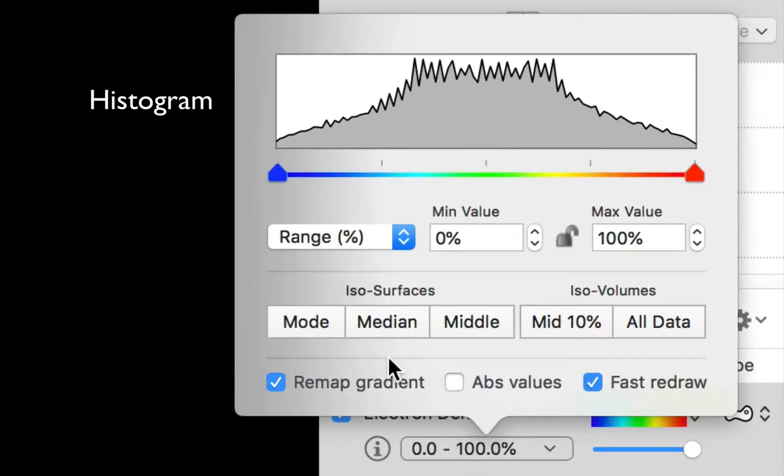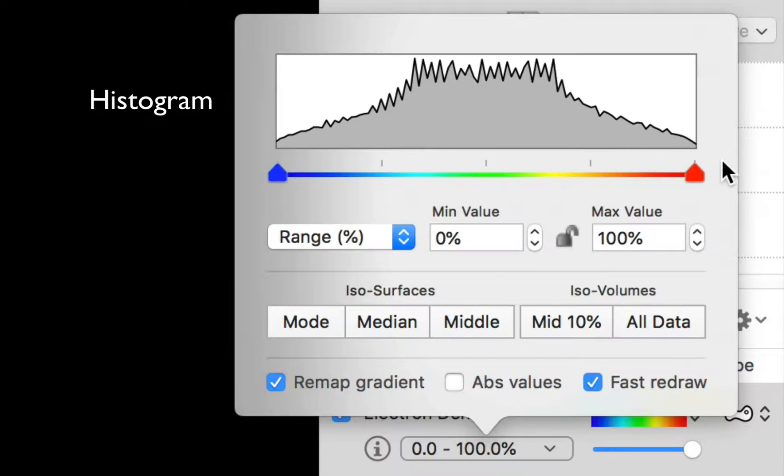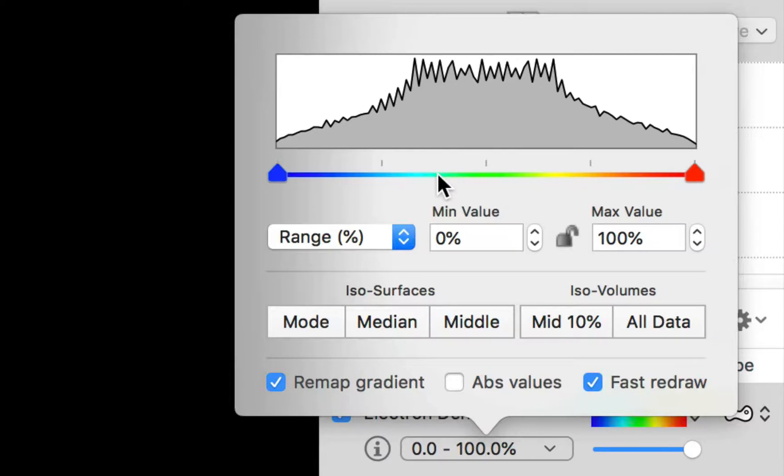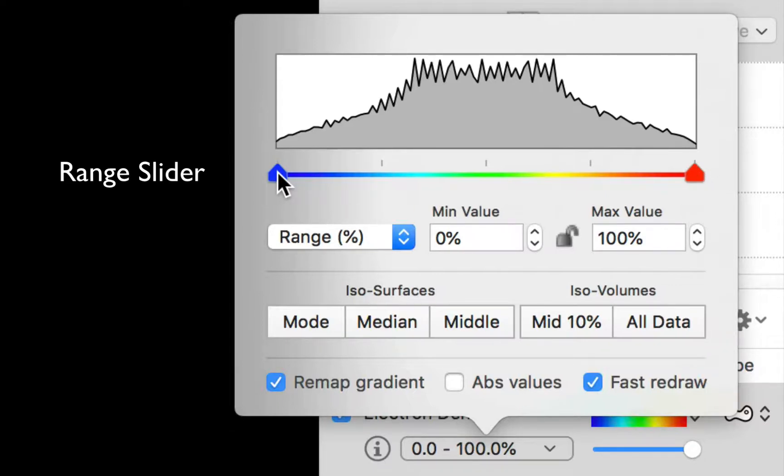And the pop-over starts with a histogram at the top that shows the number of data points with a particular value. So if we move down here, we can see the lowest values on the left and the highest values on the right. And you can see we have a rainbow scale here which corresponds to the current color gradient. And we have a pair of thumb controls.